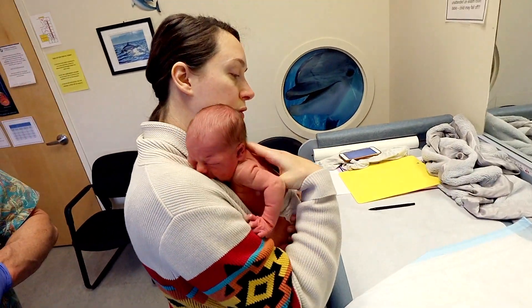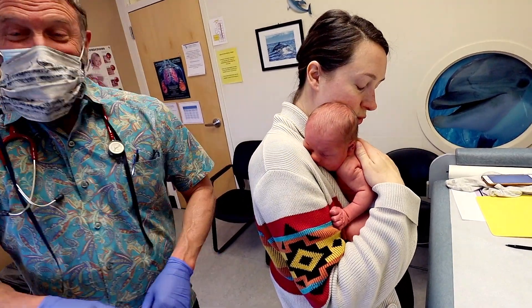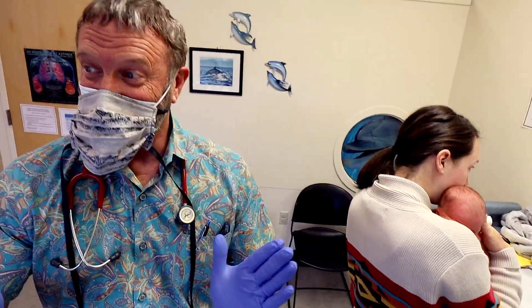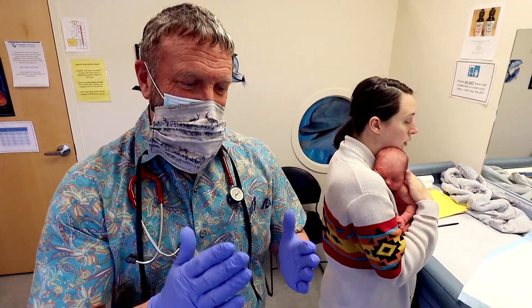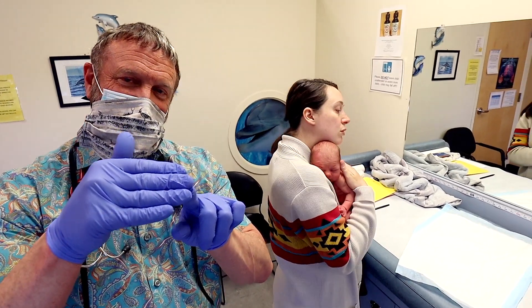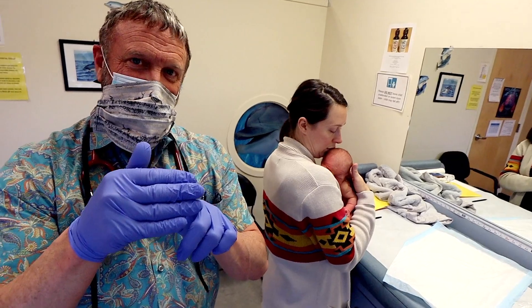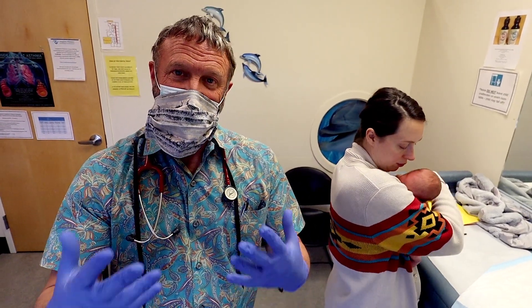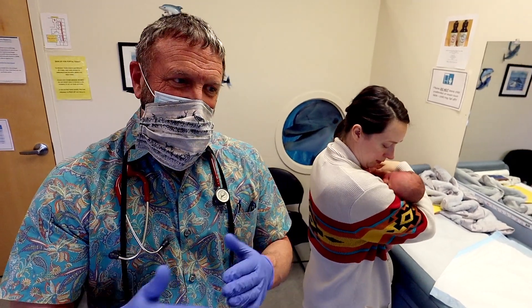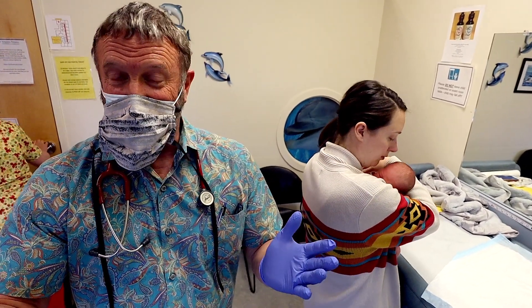Look at mama — there you go. So this is a three-day-old who's actually latching reasonably well, and we've got an experienced mom. It was somewhat optional, but that tongue was attached right basically to the end. There's going to be some improvement in the latch and better function for breastfeeding. I wasn't really worried about language per se, but we don't have to worry about it at all now.